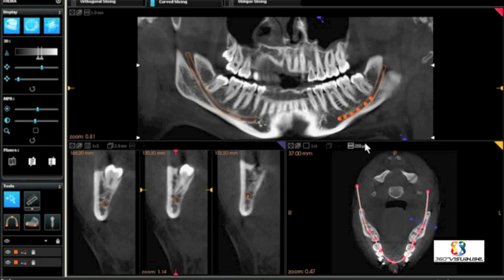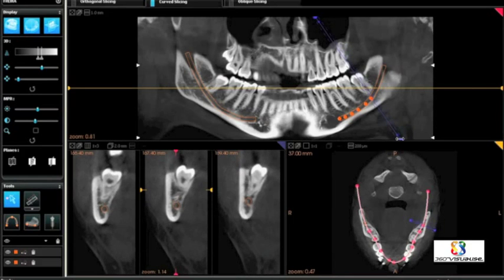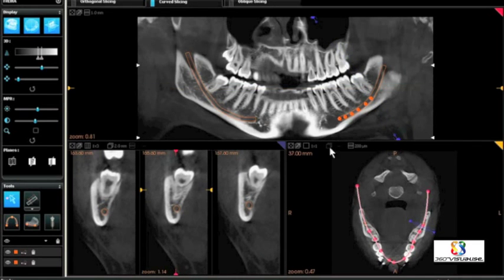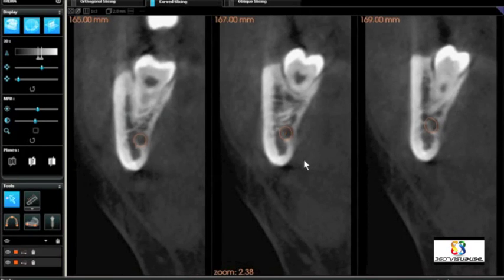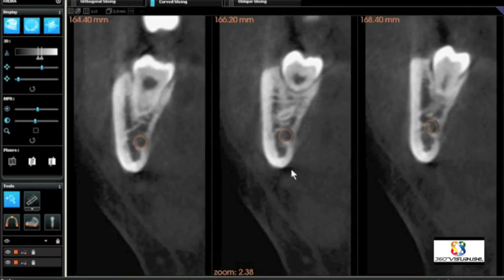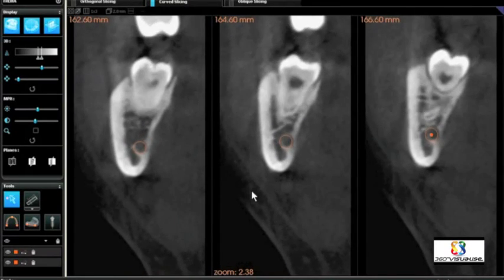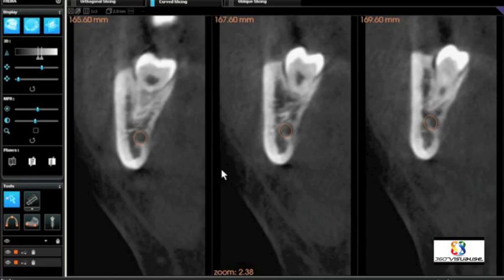Here you can see the cross-sectional cut would now be along the long axis of the third molar. In the lower left, as you can see as we make it larger, we can see cross-sectional cuts. The thickness of the cut is two millimeters.